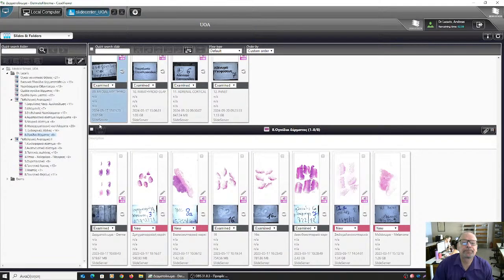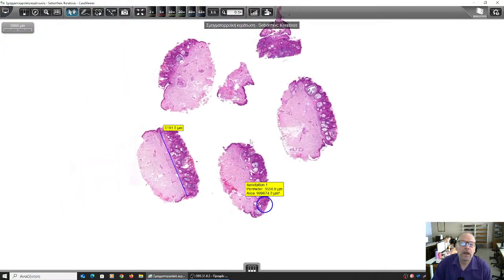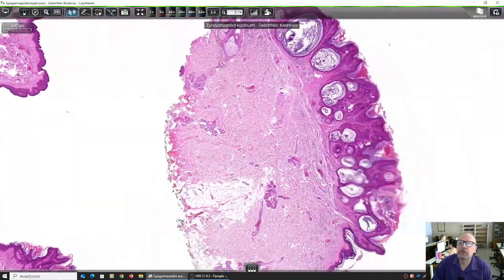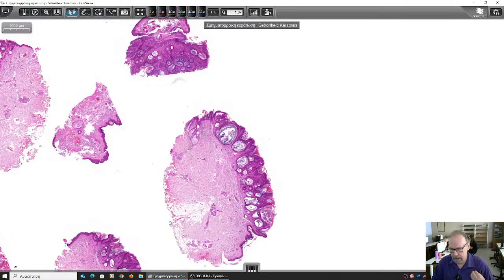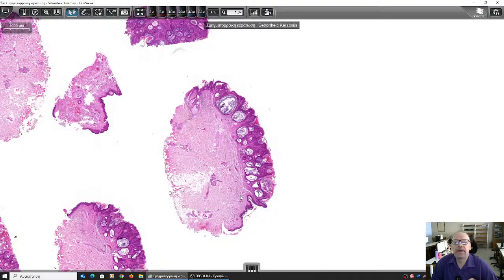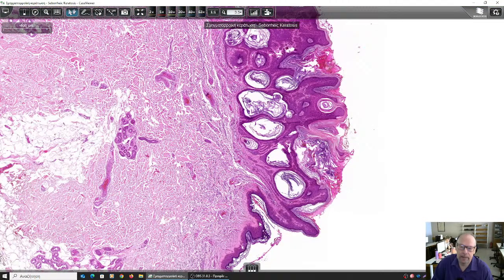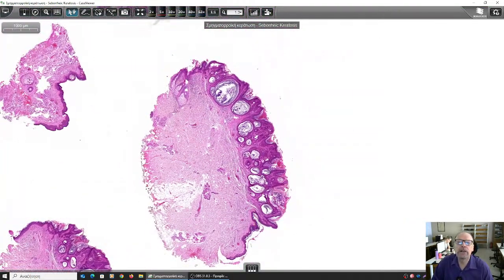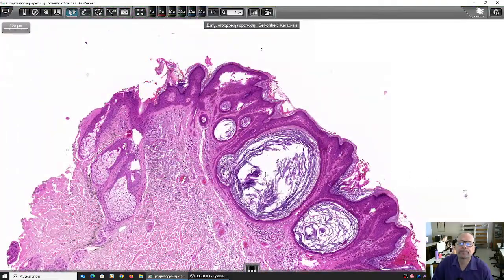So, next. This one. Oh, yes. Look. Here we have a lesion, and a main feature, this is a lesion of the epidermis. Okay. And I want you to identify how it grows, the pattern of this lesion development. Now, let's have a look at the normal epidermis. You see the keratin, the follicles? All right. And let's come to the other side, like here.